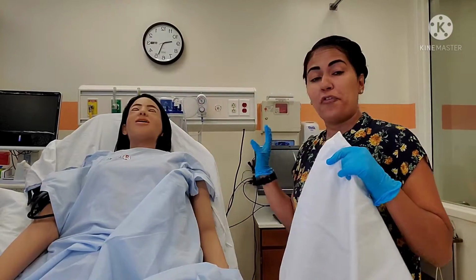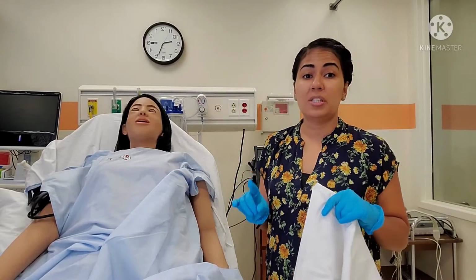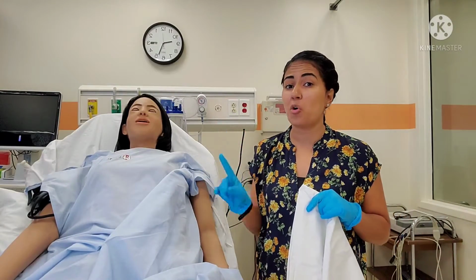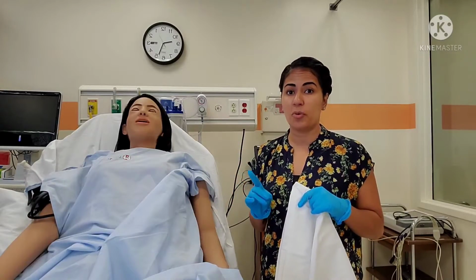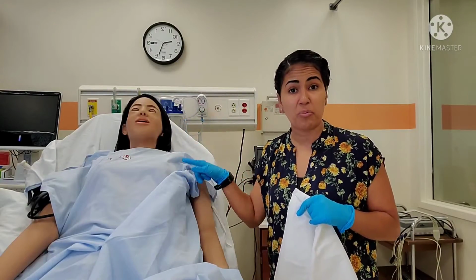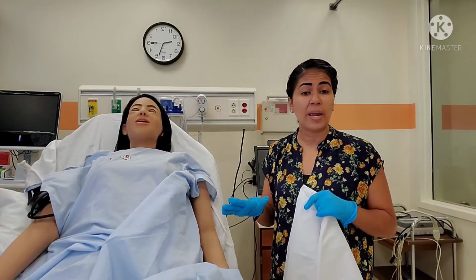So now, for the sake of assessing my patient, let's go back actually. From the moment I walked into this room, I was assessing Jamie, okay? And what was I assessing her for? All of those things that we saw earlier that made us think that she needed a chest tube, okay? So from the moment I walked in, I'm looking at her facial expression, her color, her work of breathing, her respiratory rate. If she's on a monitor, I'm looking at her SpO2, her heart rate, right?